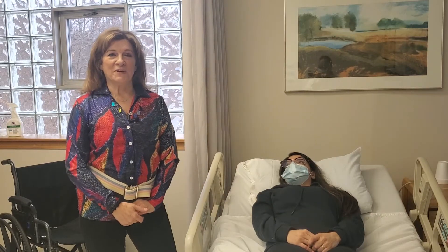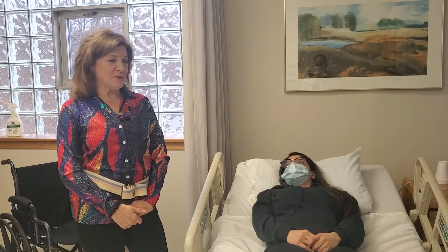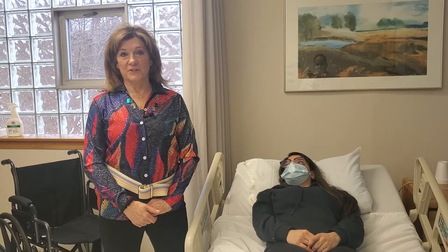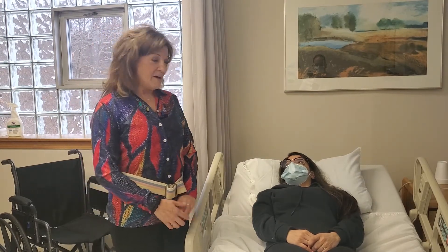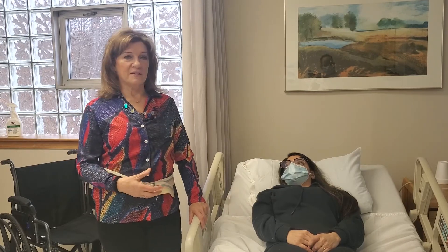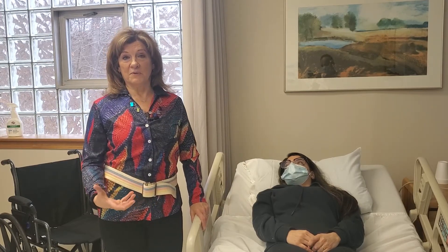Welcome everyone. It's Nancy the Nurse Practitioner here with Caregiver Success, and we're going to learn today how to transfer somebody out of bed into a wheelchair. I'm not a physical therapist but I am a nurse practitioner, and I've moved a lot of patients and told a lot of family members how to get their loved ones in and out of bed, even by themselves when they were alone.